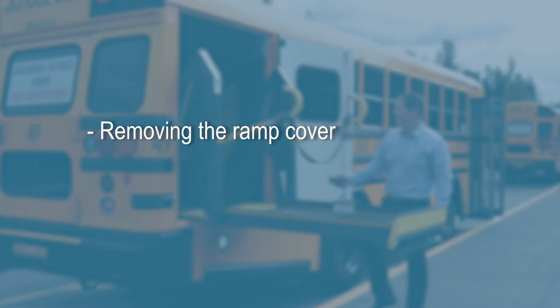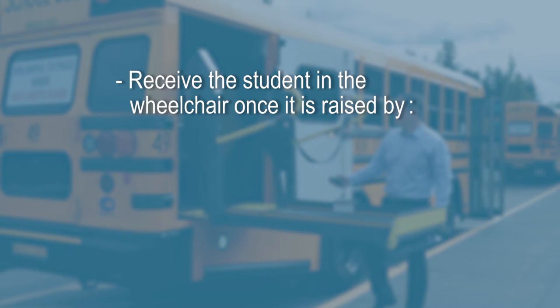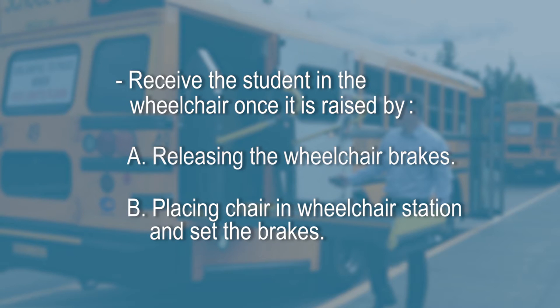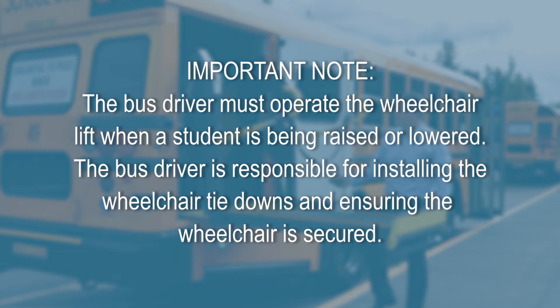A school staff member may assist in this process by removing the ramp cover, supervising the children already on the bus, and receiving the student in the wheelchair once it is raised — by releasing the wheelchair brakes or placing the chair in the wheelchair station and setting the brakes.